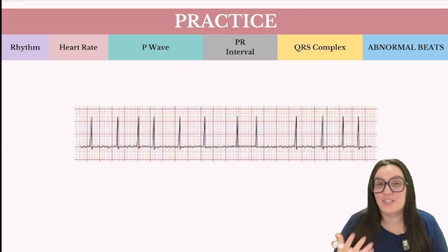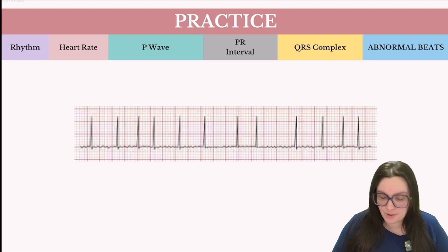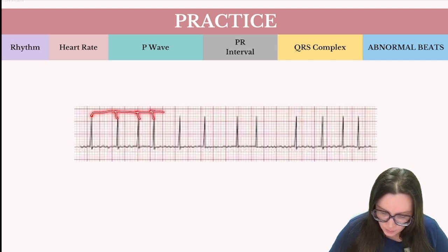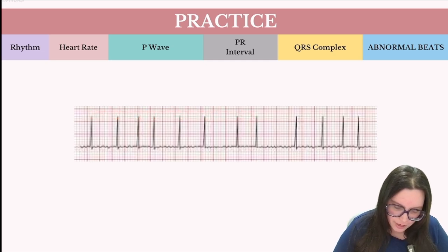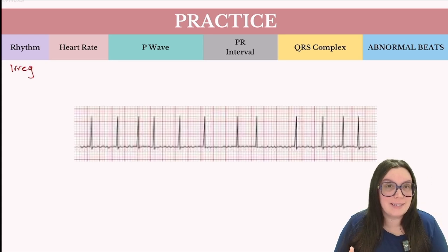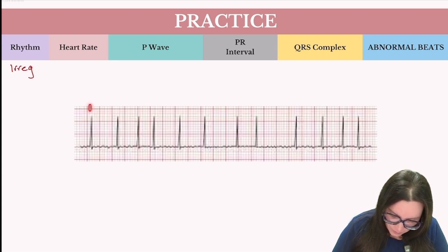Let's do some practice. We begin by identifying our rhythm — is it regular or irregular? If I measure out my R-to-R complexes, you're going to see that they don't fall in the same place every single time; some are longer, some are shorter. So we can identify this as an irregular rhythm. Because it's irregular, we're just going to count our QRS complexes: 1, 2, 3, 4, 5, 6, 7, 8, 9, 10, 11, 12.